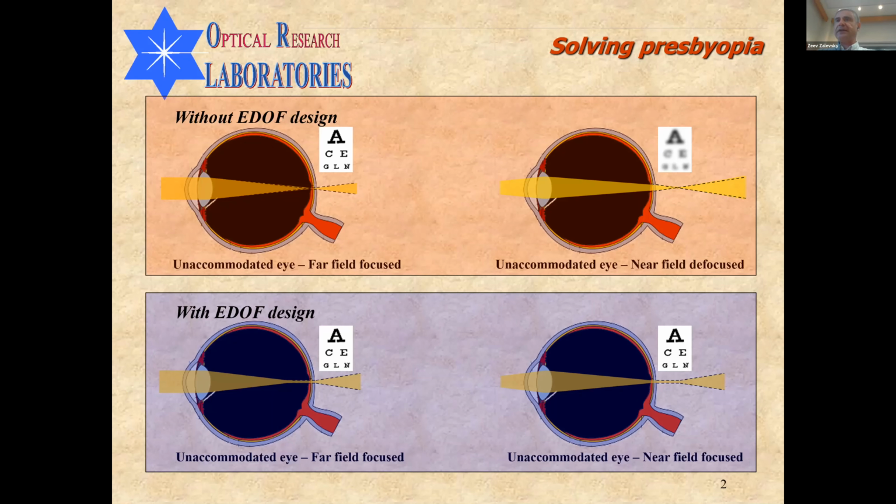If you use it for spectacles, then you gain due to the fact that you see everything in focus over the full field of view, you don't need to find the right line of sight to have the object you look at to be in focus. And if you use contact lenses or intraocular lenses, then you have everything in focus from near to far distance, and not only the near or the far distance, but also all the objects that are in between.